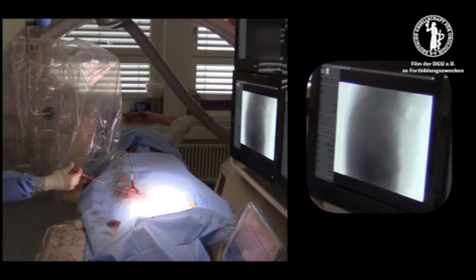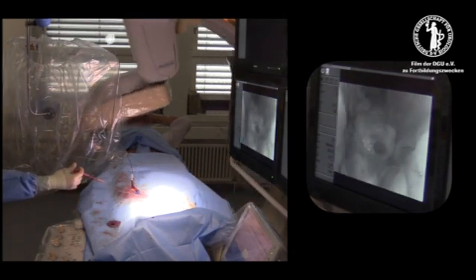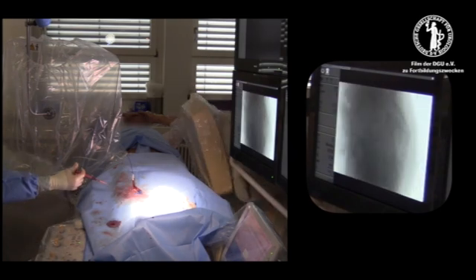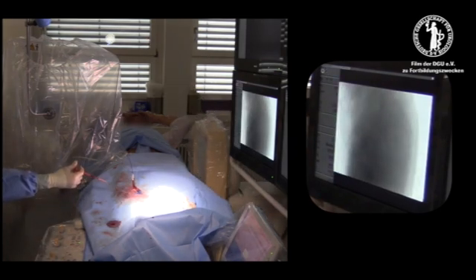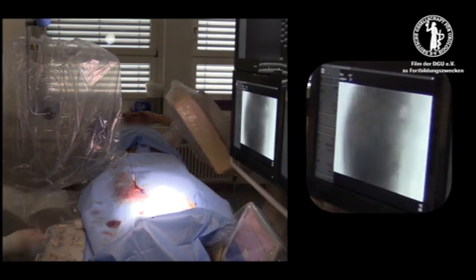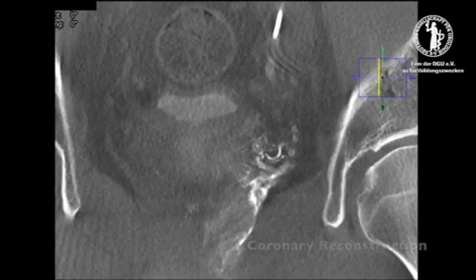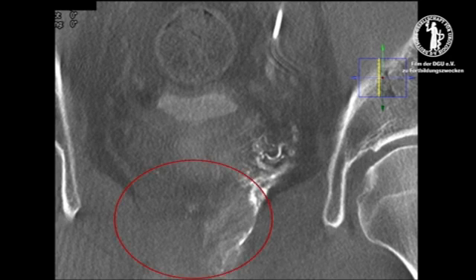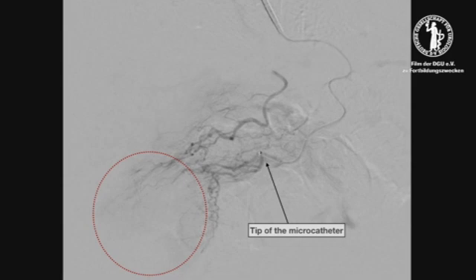To confirm that our branch is the supplying artery of the prostate, a rotational angiography is performed. This technique functions like a CT scan, adding and layering the circumferential images of the pelvis. Here we see the coronal reconstruction of the prostate, confirming this branch as the supplying branch for the prostate. The correct position of the microcatheter is again verified.